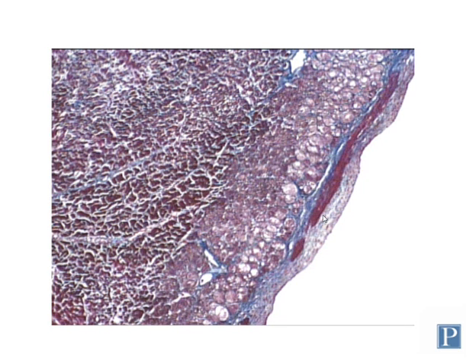So moving along, this is a section of the inner part of the heart. We've looked at this before early on in lab. As you may recall, this layer of the heart is called the myocardium, and it contains the contractile cardiomyocytes, which stain a deep reddish color.